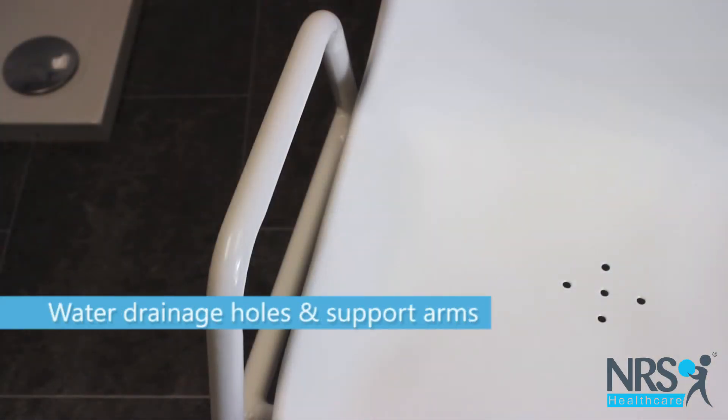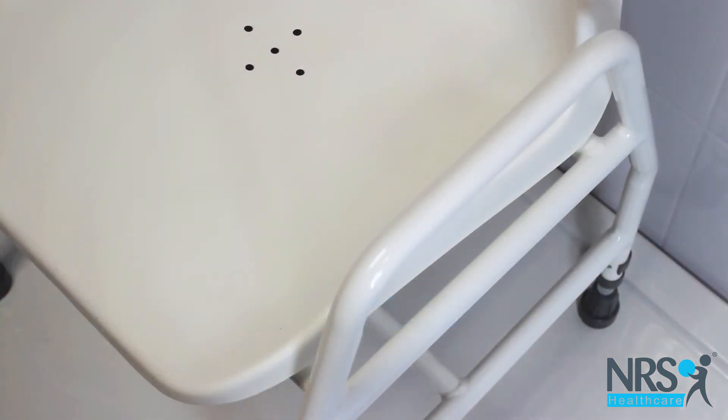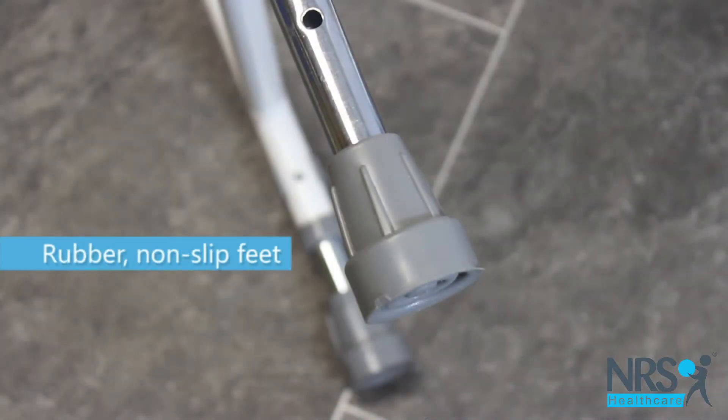The seat features small holes to allow water to drain and arms to support you when standing and sitting. The feet are made from non-slip rubber for safety.